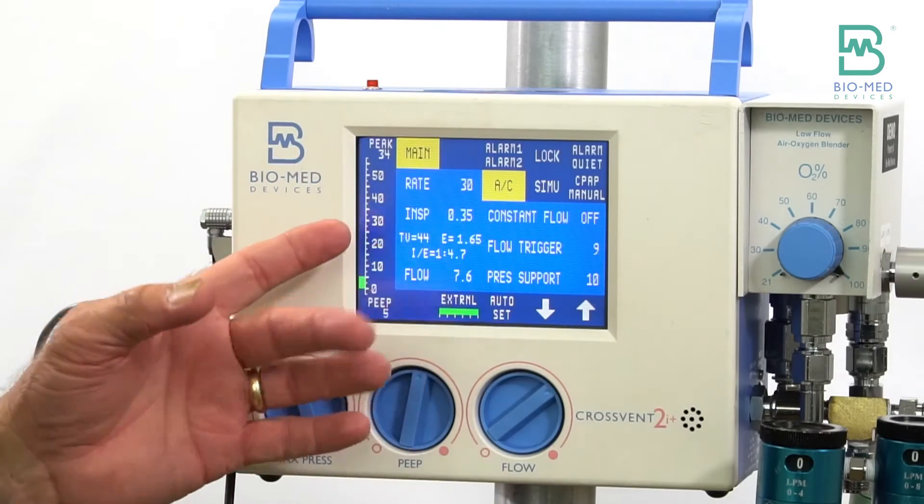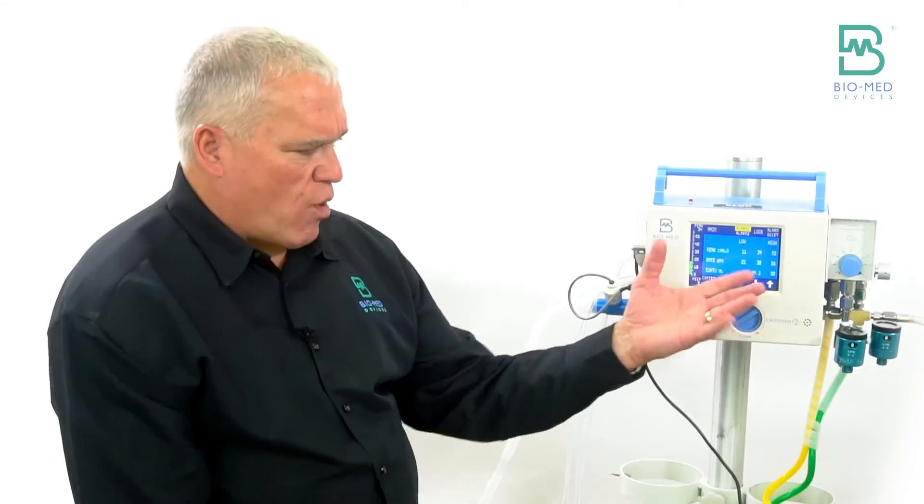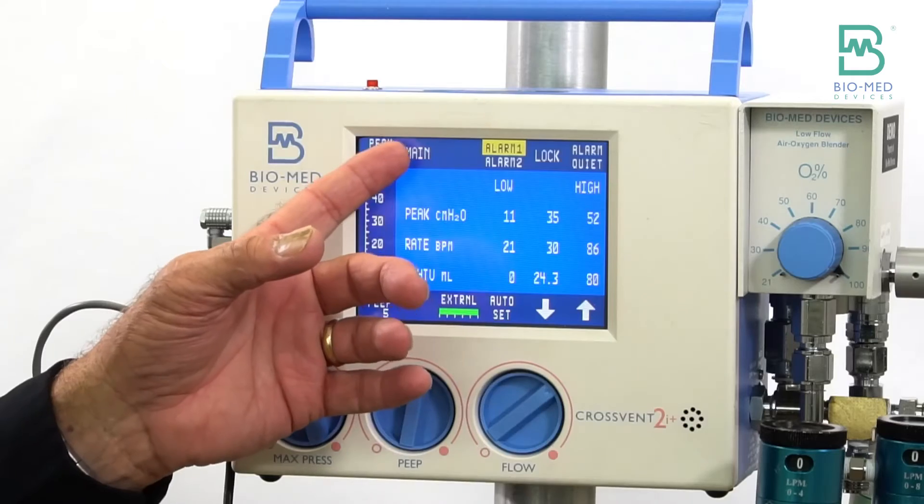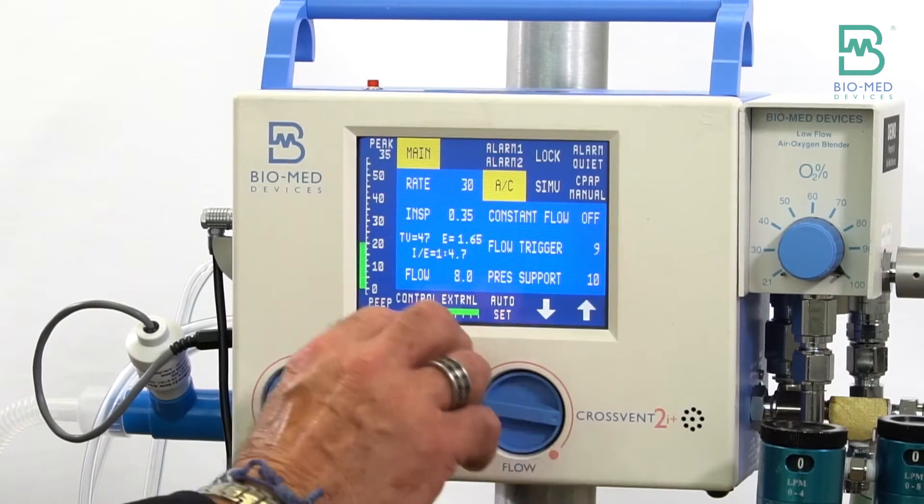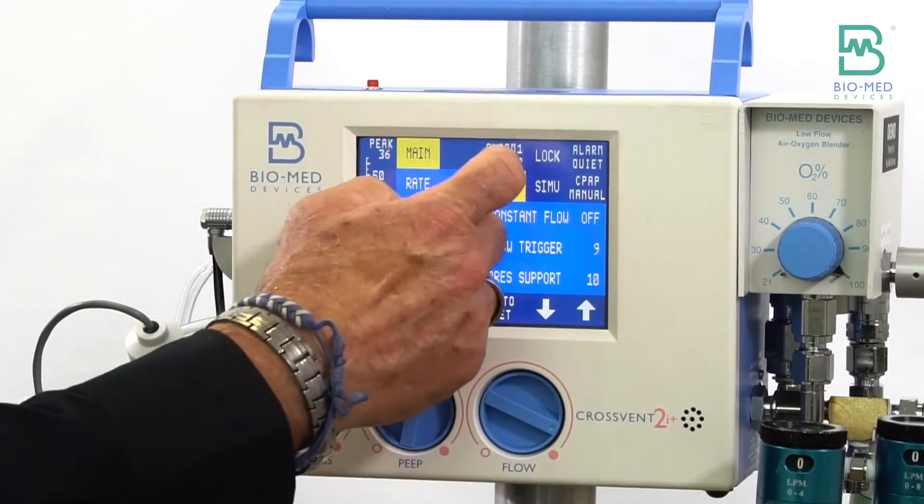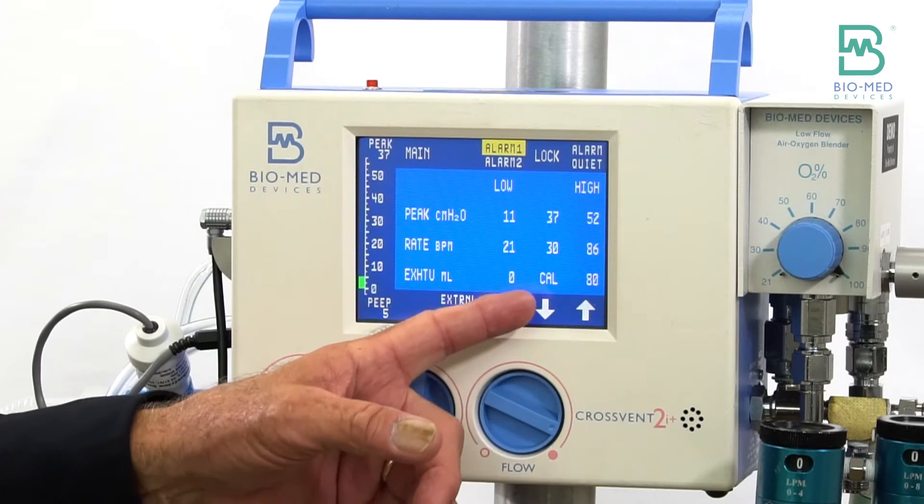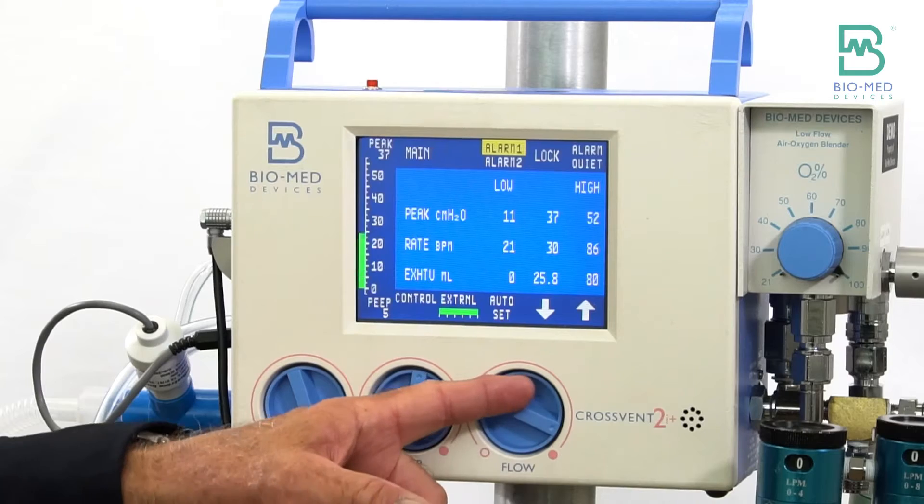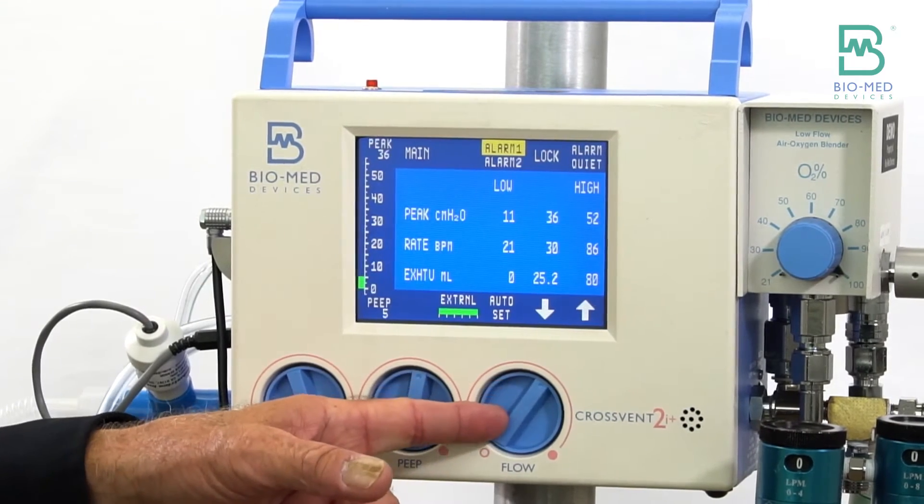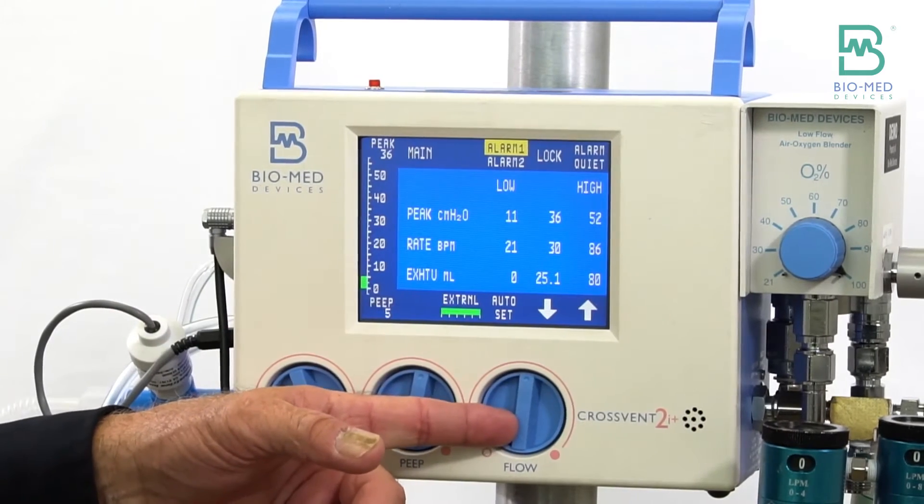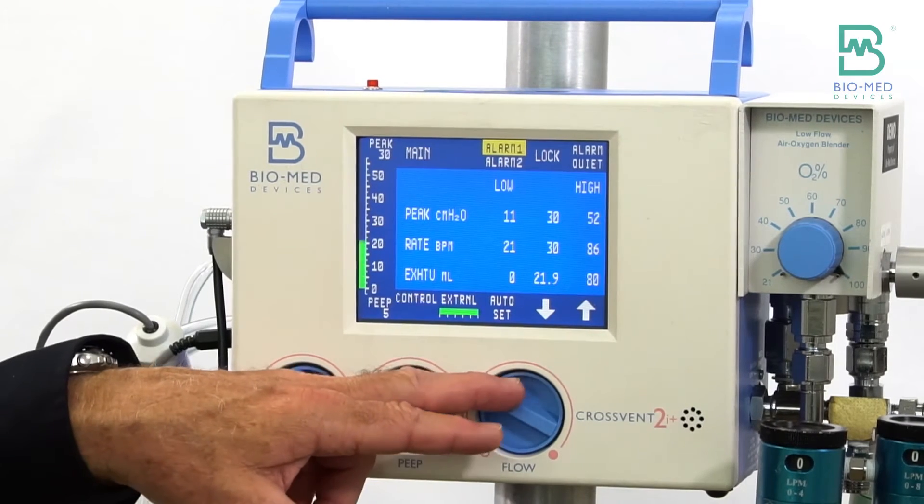So if I look at my exhale tidal volume I'm at 24, so you're pretty close. But the point is that as you adjust your flow you're changing that volume. So all I would really need to do if I really wanted, say, 25 - you can adjust your flow up or down. If I wanted 20, as I turn my flow down I'm actually decreasing that set volume and you can dial in your volume that you want.